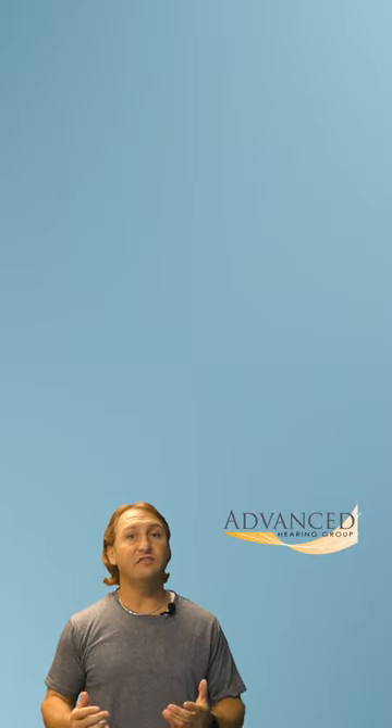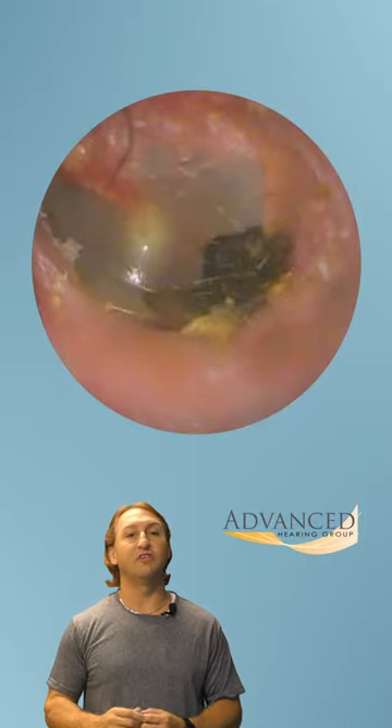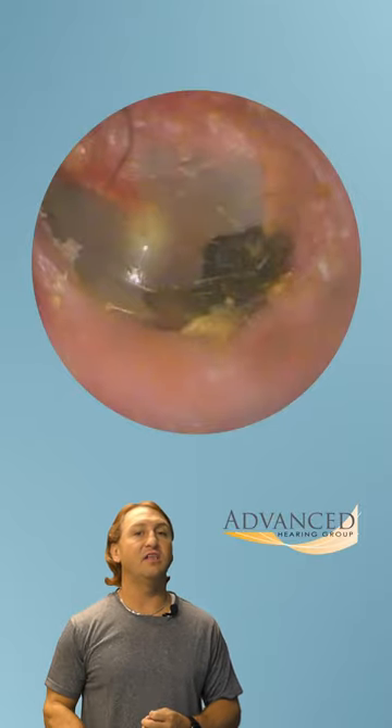When I look back at this video, I noticed I messed up — I missed some at the base of the eardrum. Normally I would go in and get that out either with the curette or possibly some irrigation. Sometimes even those of us who do this for a living, we miss bits. I'll try to point it out whenever it happens.